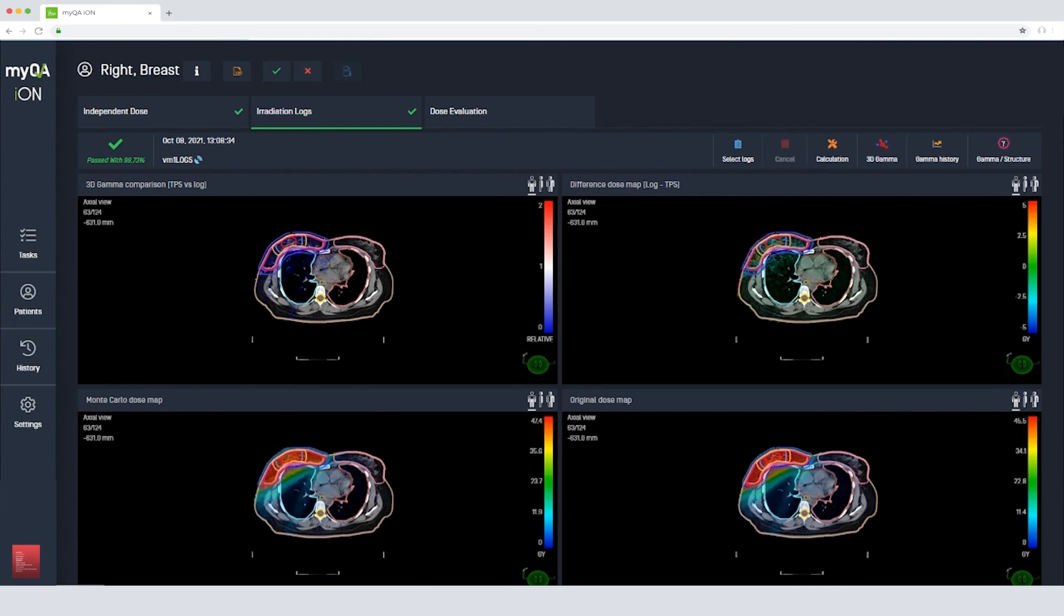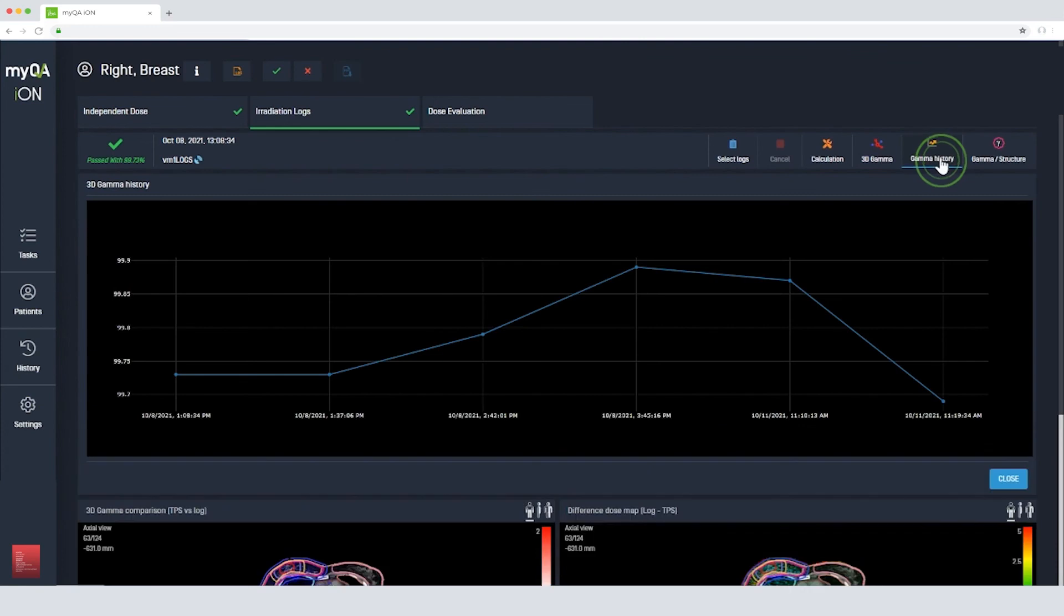We can also see a log file history. This will highlight any reoccurring or random errors, enabling you to investigate whether patient setup or machine performance is causing the deviations.